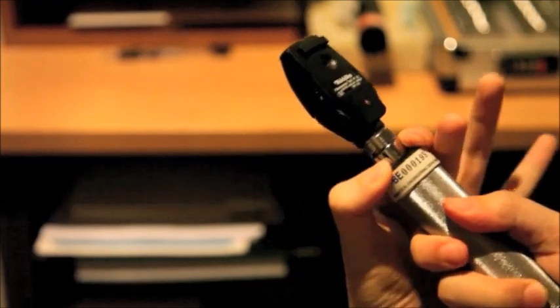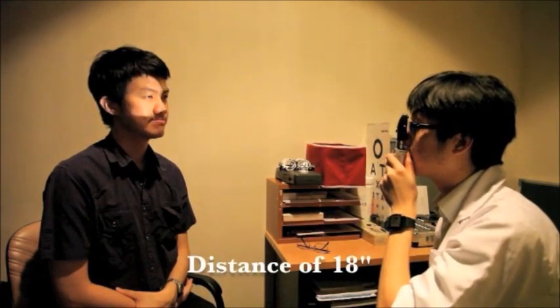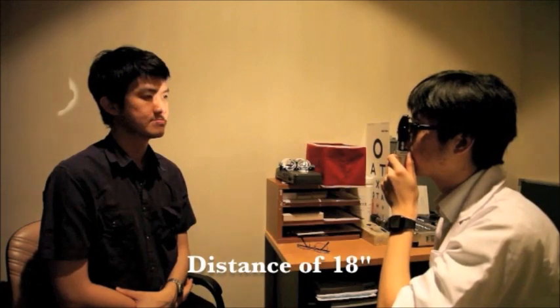Turn on the ophthalmoscope and set the lens power to zero. Look through the aperture and shine the light onto the patient's eyes. Examine the red reflex from both eyes simultaneously and then from each eye separately. Note that this test has to be conducted at a distance of 18 inches.